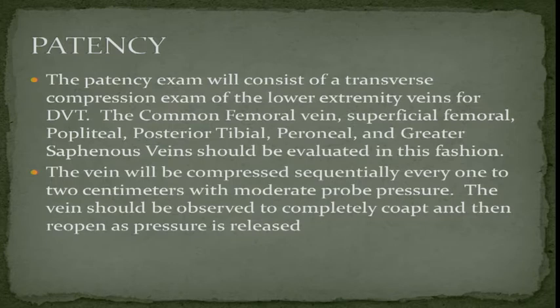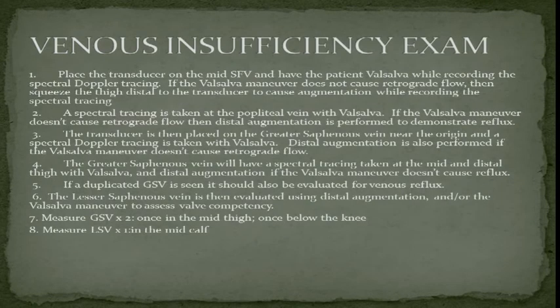So when we do a DVT study, it's not just that the vein compresses. That's the active phase, where the vein compresses when you apply probe compression. Then there's a relaxation phase. The vein opens up when you release the pressure. So both parts should be observed by the technologist.